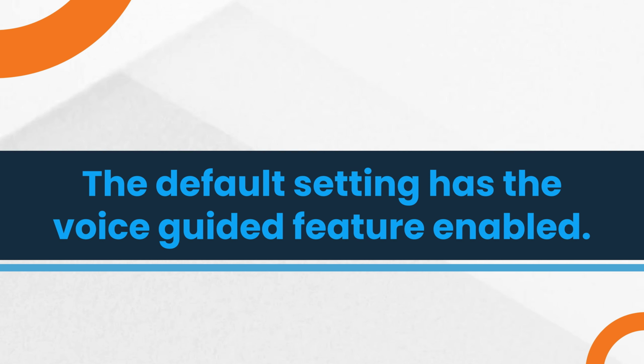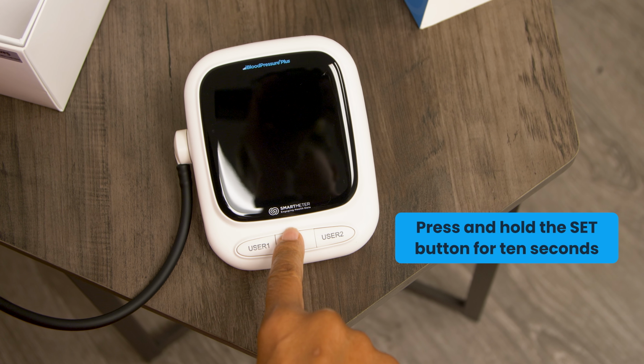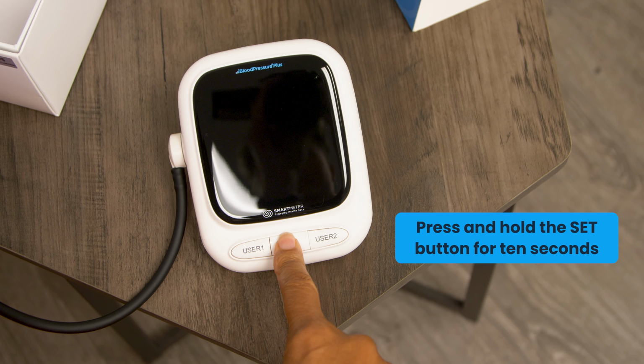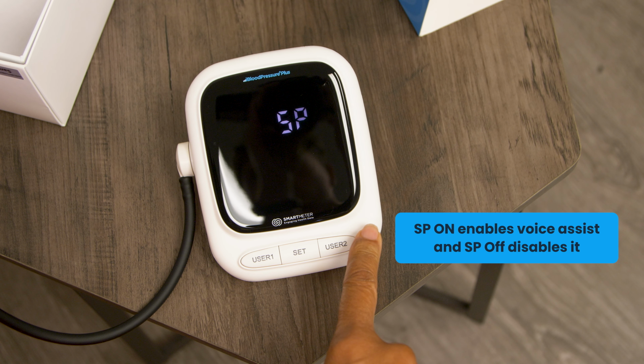To customize the settings on your iBloodPressure Plus device, follow these steps. When the device is powered off, press and hold the Set button for 10 seconds. The symbol SP will appear on the screen, indicating that settings are now adjustable.